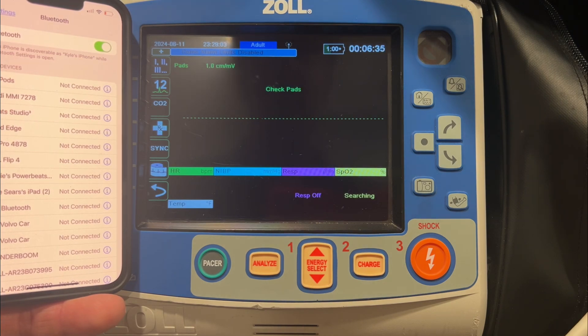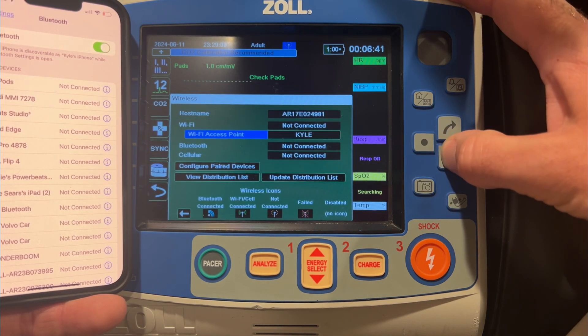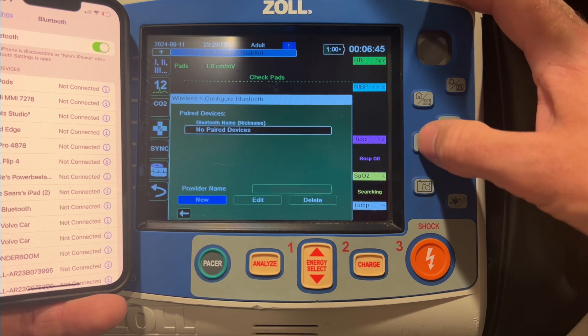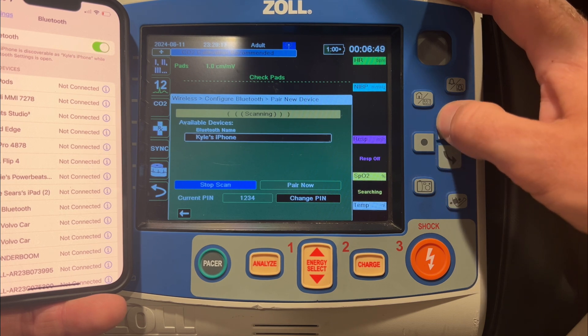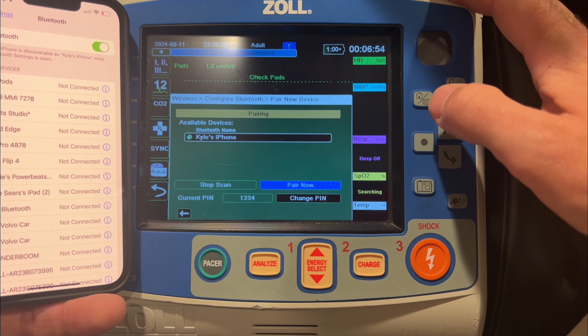It's really important that the monitor sees the phone or iPad. To do that, go up to the antenna and navigate down to where it says 'Configure Paired Devices.' Hit Enter, select New, and it's going to do a scan. Select your device — Kyle's iPhone in this case — hit Pair Now, and the pairing will take place.